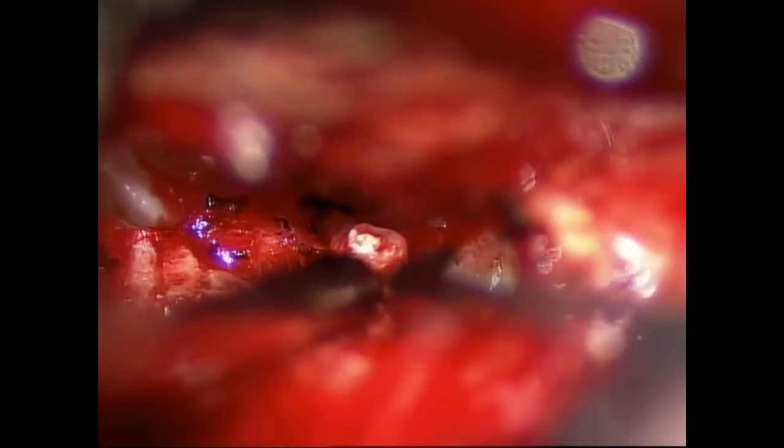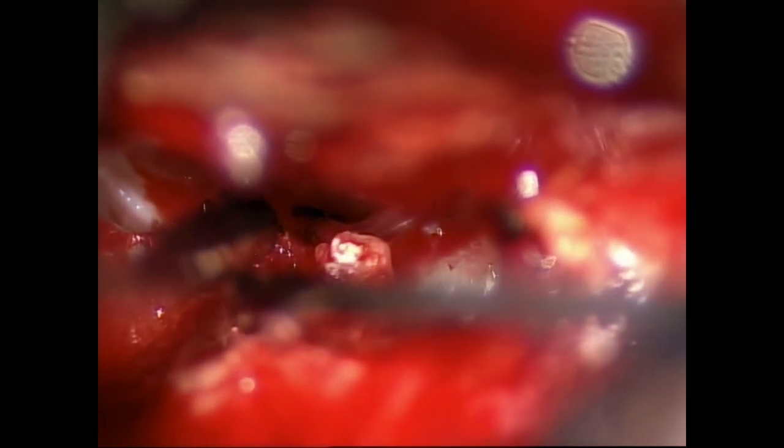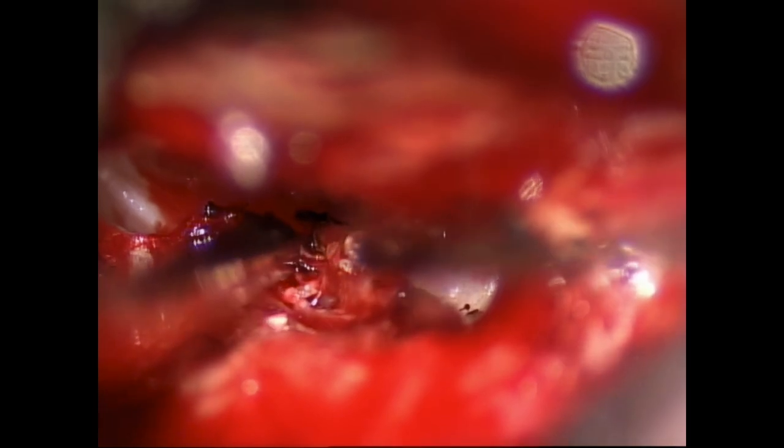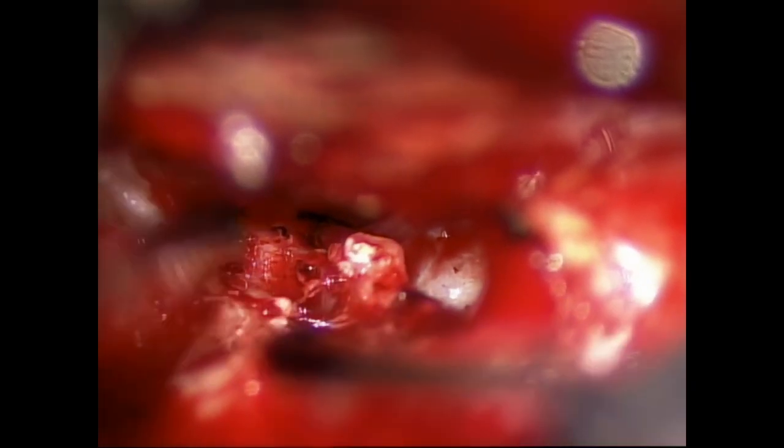Here I've identified the stapes superstructure carefully, atraumatically with the laser, and you can see in the distance that there is a relatively good space in the middle ear and good ventilation around the eustachian tube area.